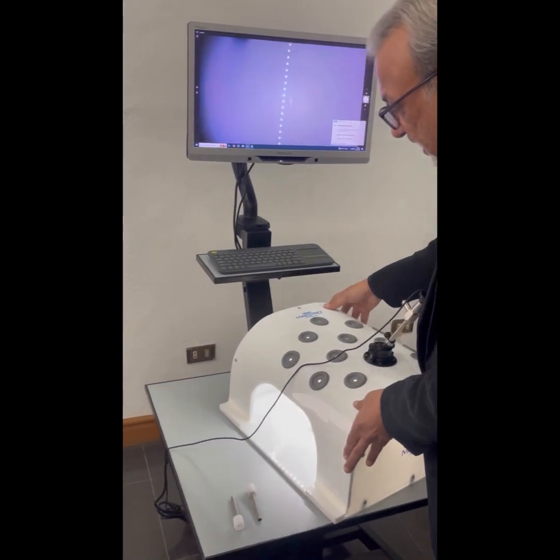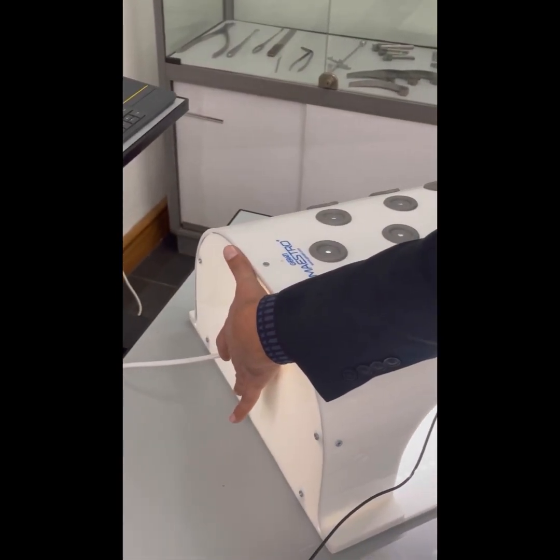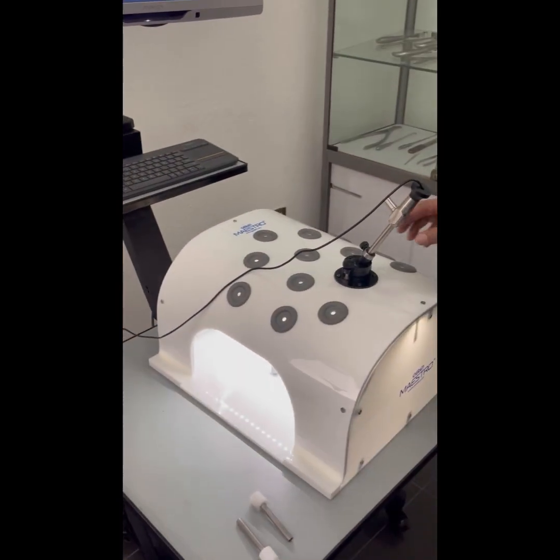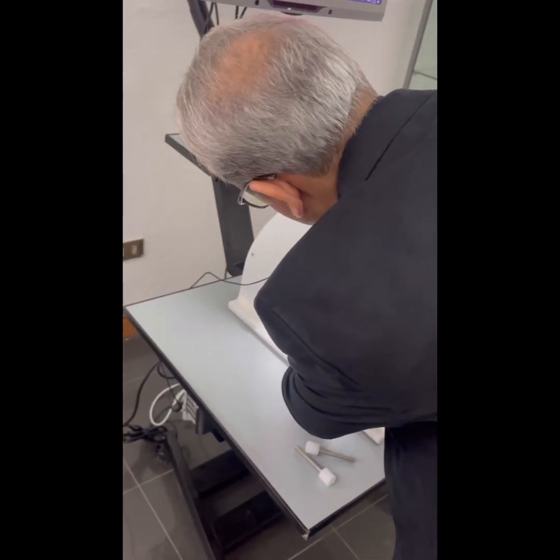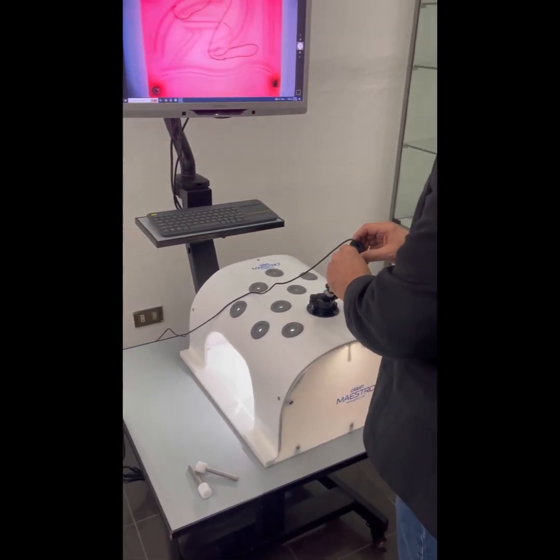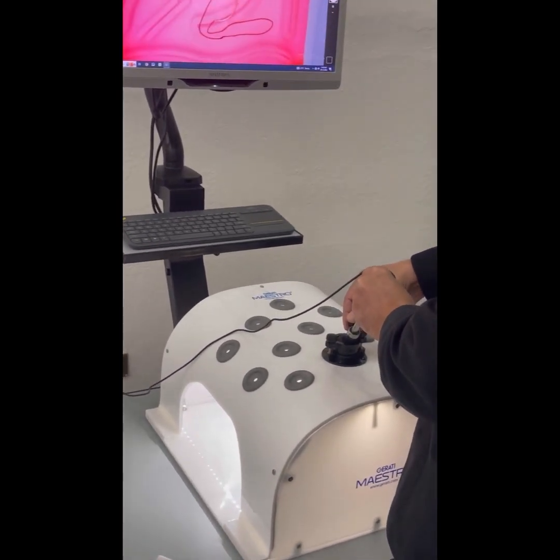The trainer also has a built-in LED light with a switch on the back side that can be switched on and off. Once the camera is in position, you select a laparoscopic training task — for example, the suturing plate — and position it inside the trainer. The camera view can be zoomed in and out.